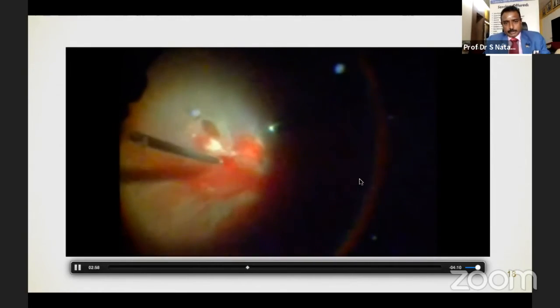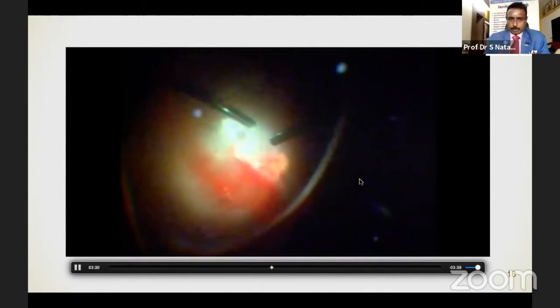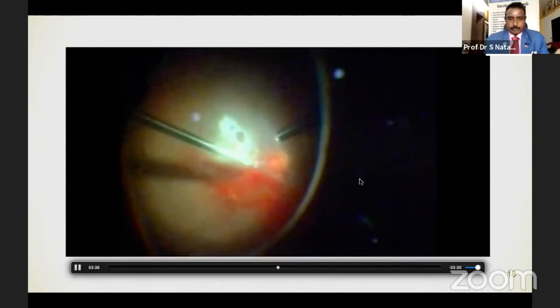And now I'm again dissecting the fibrous tissue near the break, and you are seeing pre-retinal hemorrhage which has happened, which I'm also clearing using the vitreous cutter. And I am diathermizing the edge of the fibrous tissue and the break so that the attachment can be severed, so that there's no traction persisting after the completion of the vitrectomy. Here I'm using the vitreous cutter and removing the pre-retinal bleed. The idea is not to take the instrument out and put in a vitreous brush, the back-flush needle, but you can use this. You can see now I'm clearing, and this is again diathermizing the fibrous tissue.